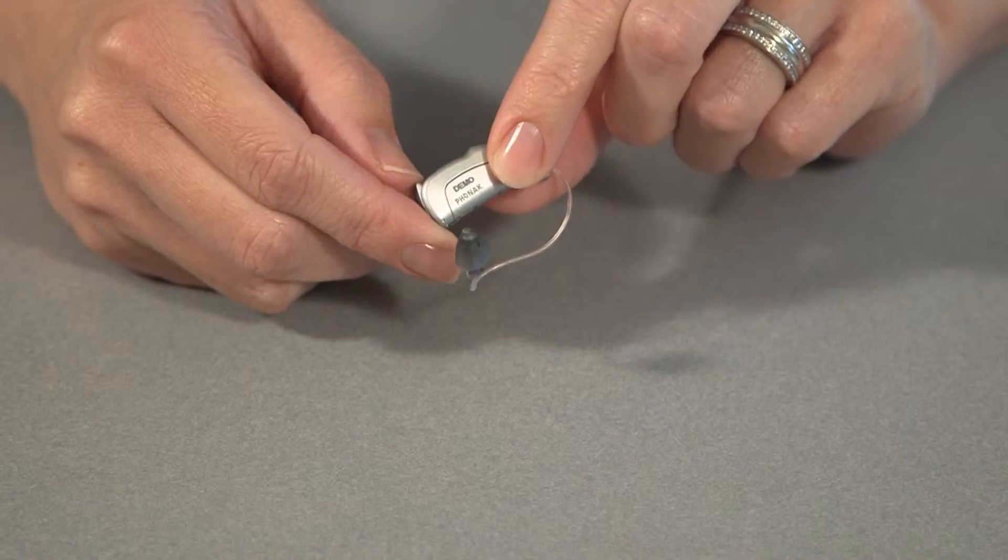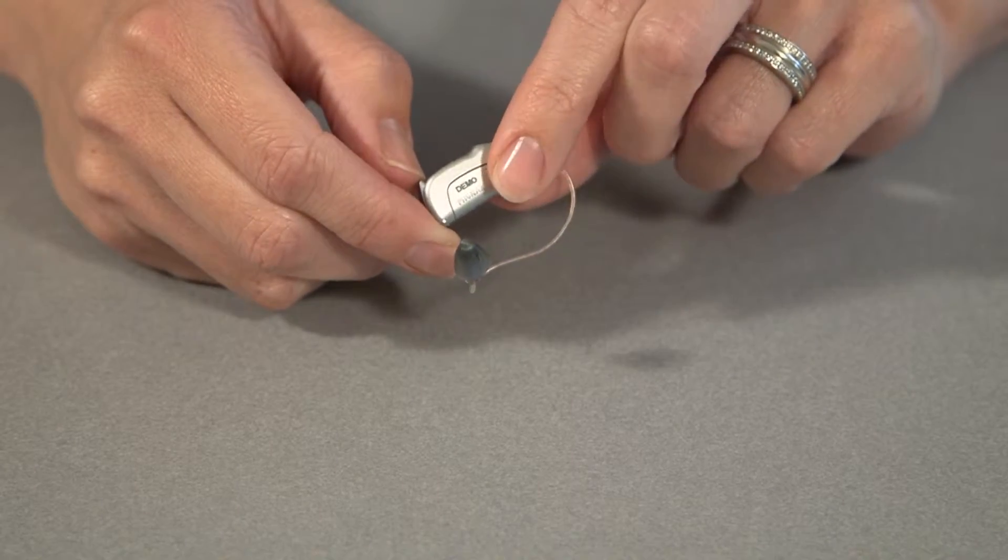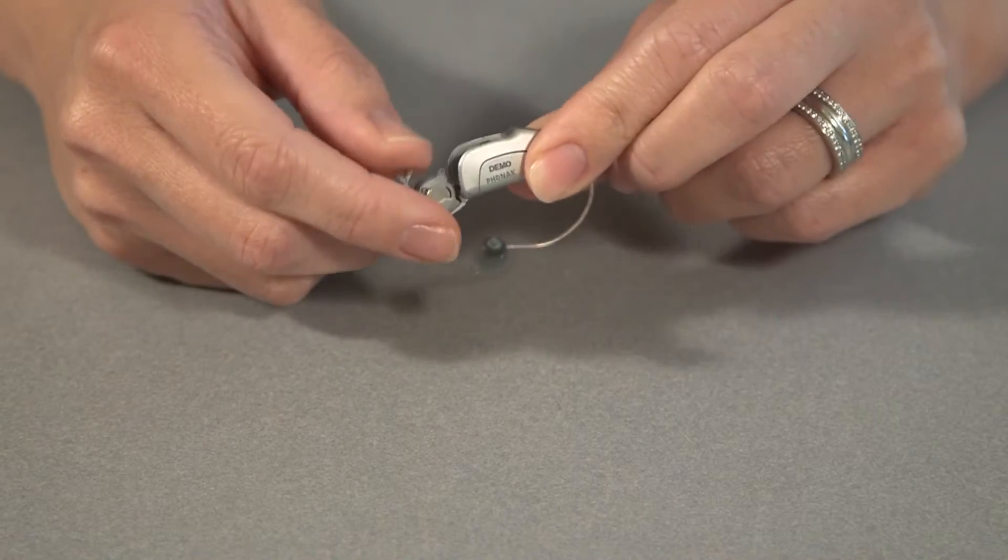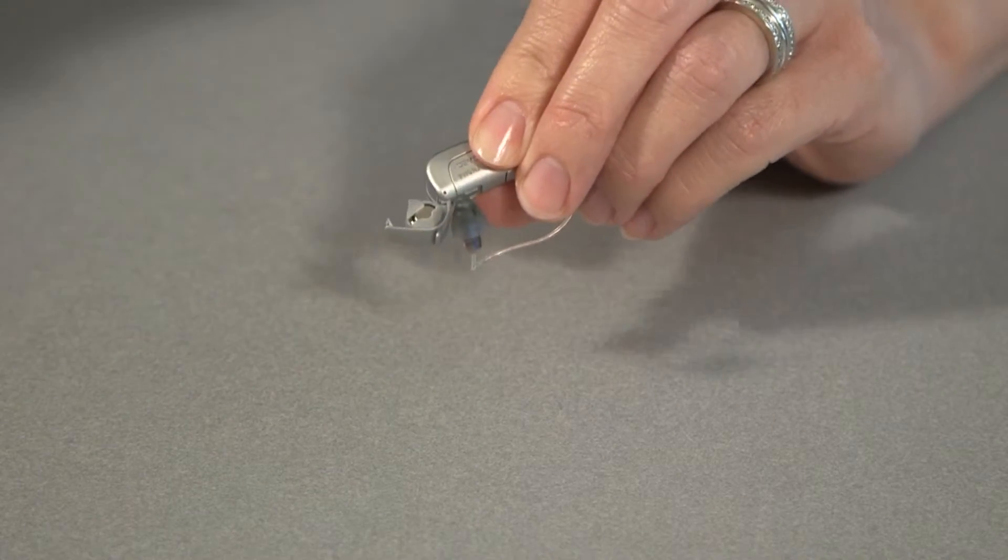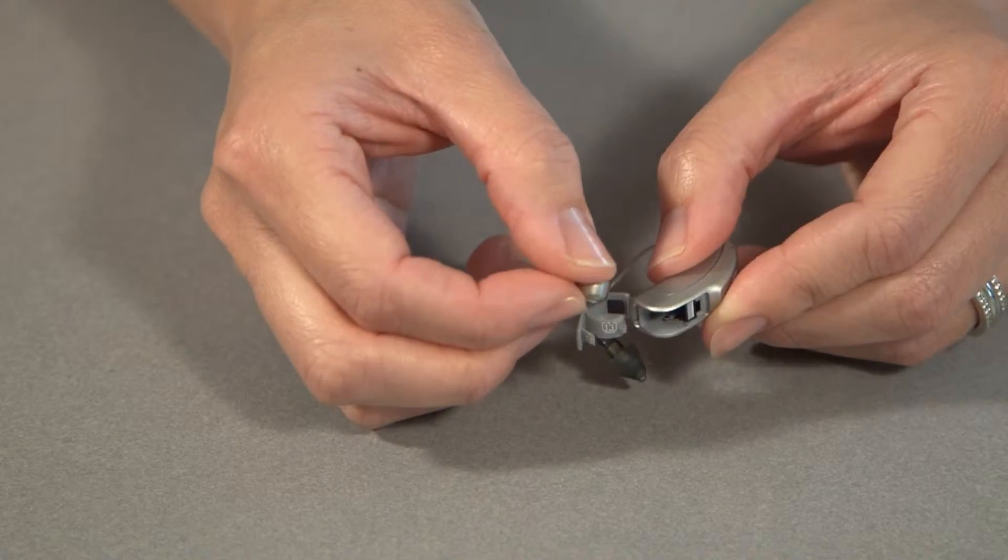And this is another receiver in the ear hearing aid. The first thing you want to do is replace the battery. So we'll take out the old battery and put in a new one.